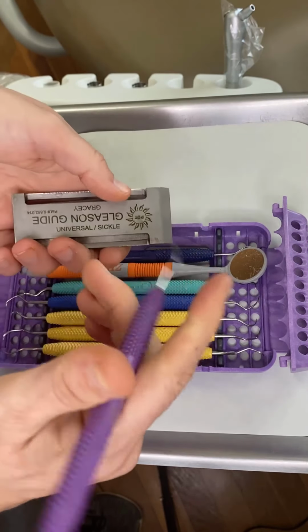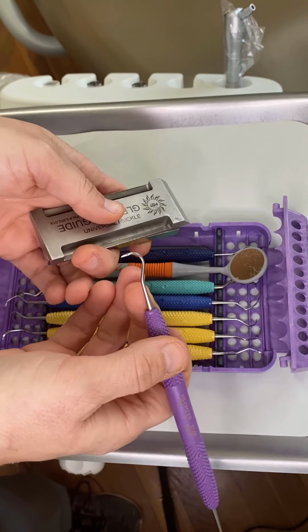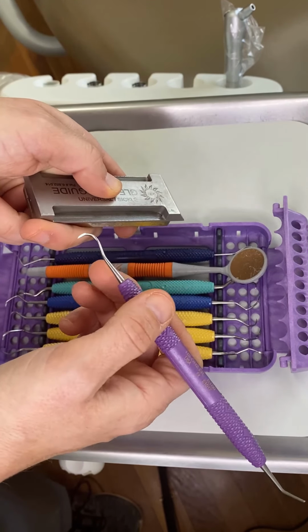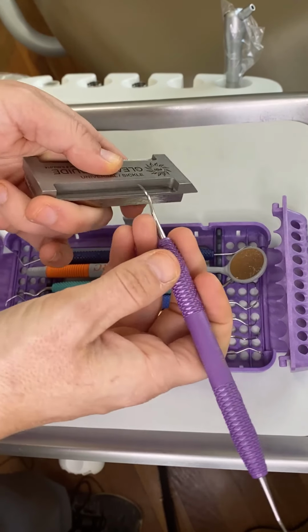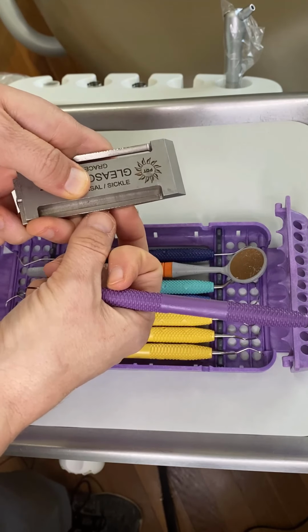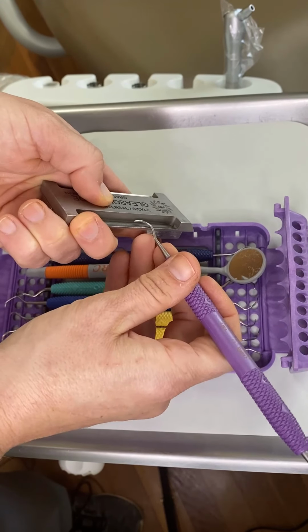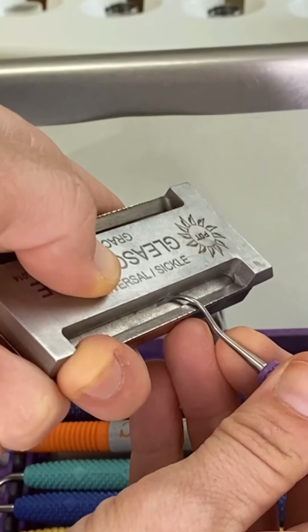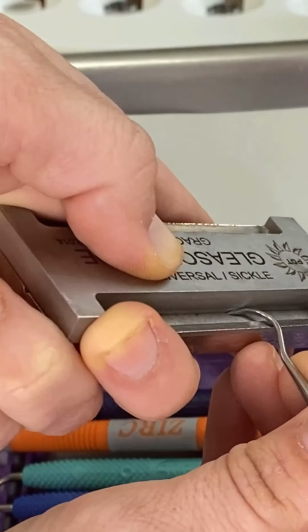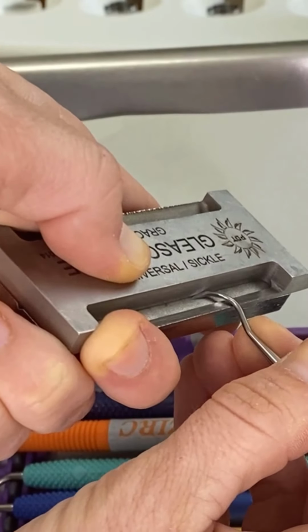Now the key to this, and this is where I see a lot of my fellow clinicians, when I show this to them if I'm ever at a booth, and definitely with my students, is the fact that you have to have 3 points of contact. So you're going to be up against the wall, you're going to be on the ramp, and then you have to make sure that the blade is actually on the guide or the sharpening stone itself. So against the wall, pull it down towards the ramp, make sure it's nice and even. Can you see how everything fits? And then there's a way to jack this up.